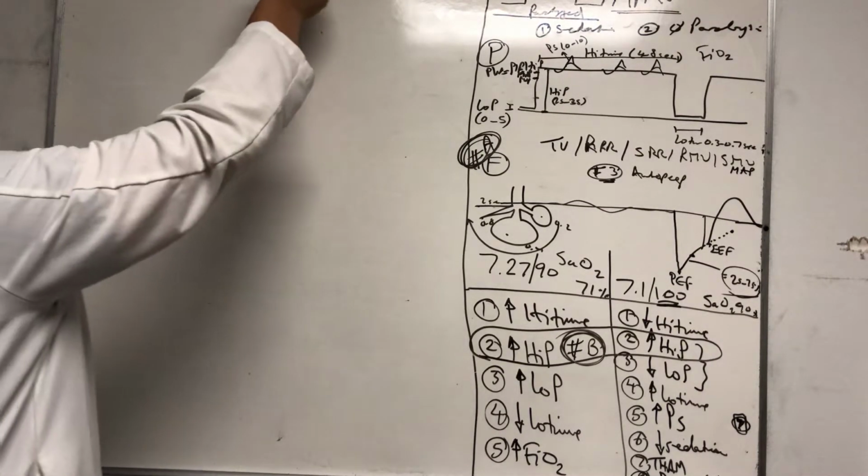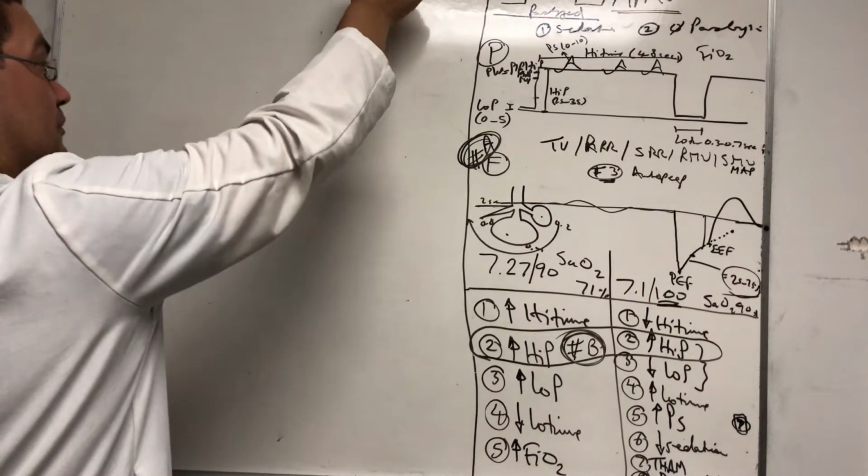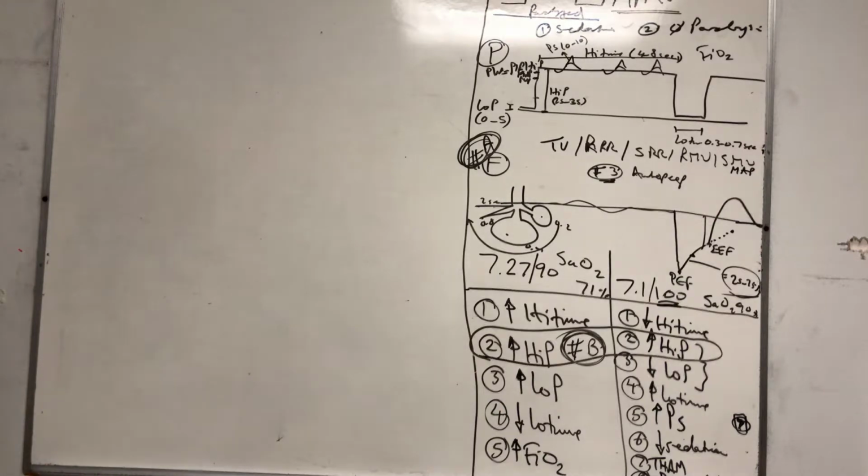And it's mainly done for patients who are still hypoxic, or still needing recruitment. So typically when we put somebody on APRV, if we do a classic APRV, the lung looks better on the x-ray.